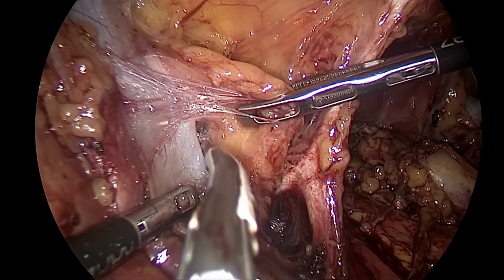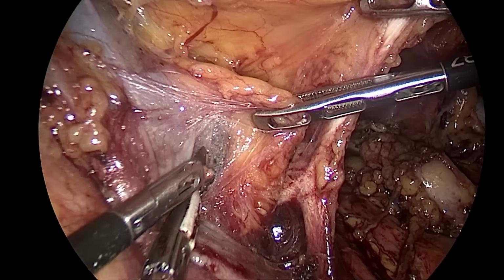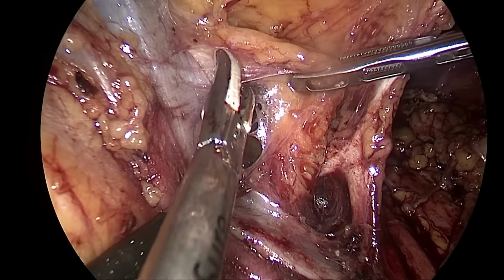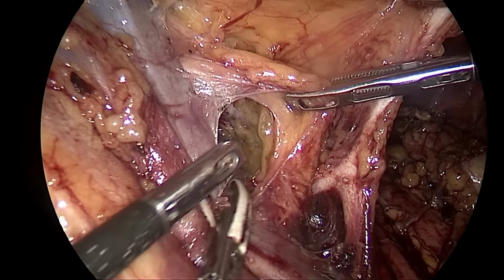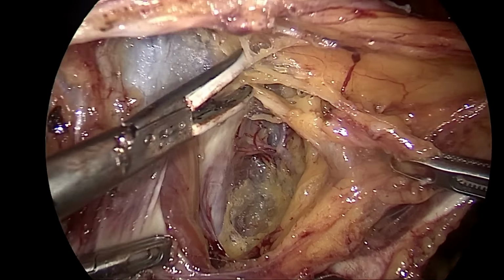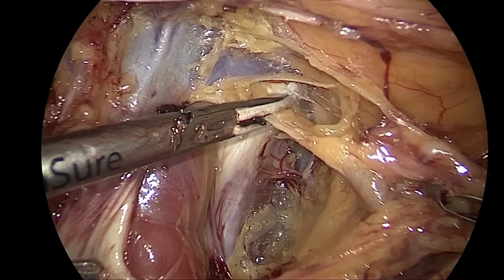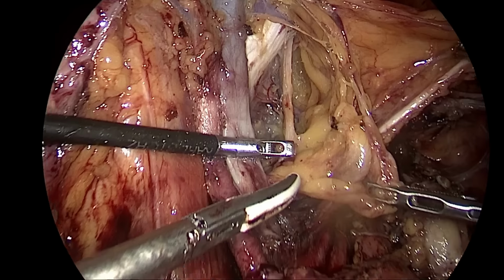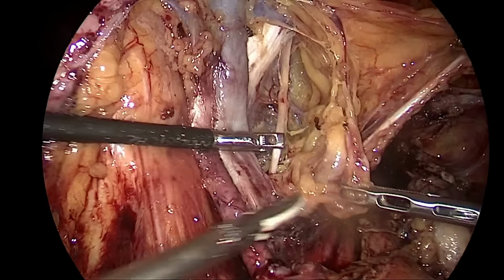So this large node is out. Now we are moving into the obturator fossa, separating the obturator group of nodes from the external iliac vein. So that's the area of corona mortis. Yes, this is the corona mortis. You can identify the bone. So that's the lateral limit of pelvic node dissection. That's our obturator nerve. So we have separated all the lymphatic tissue from the obturator nerve.